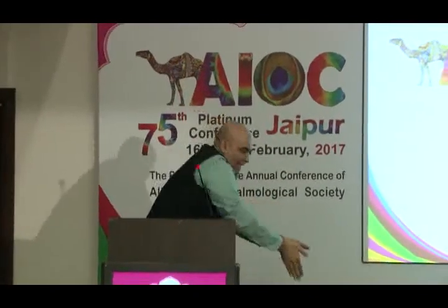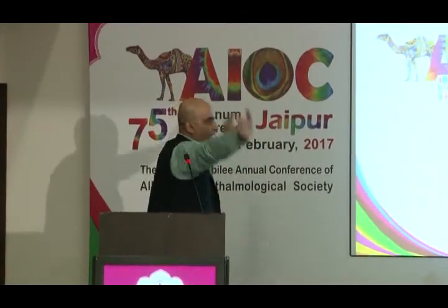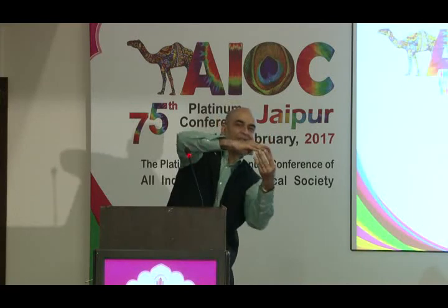If the lens opens like this, it rubs the anterior crystalline lens when it opens. So I backfold it. My cartridge, the lens is like this. Most of the surgeons are folding it like this. So when the lens opens, it rubs the crystalline lens, especially when you're using a larger diameter, more than 6.75.